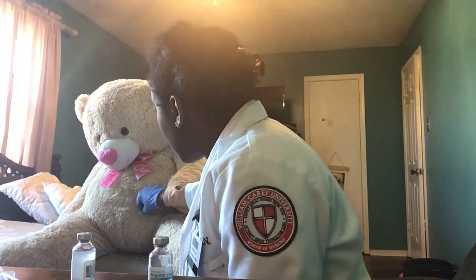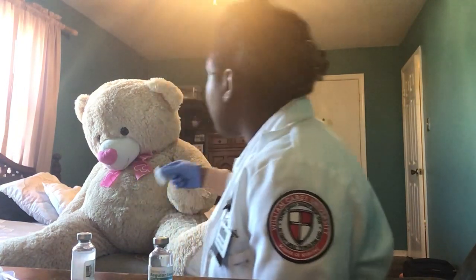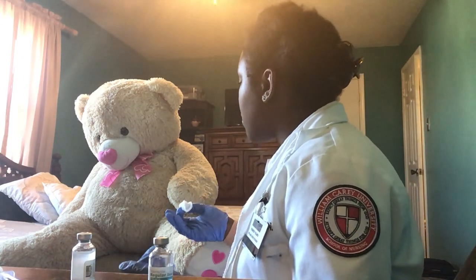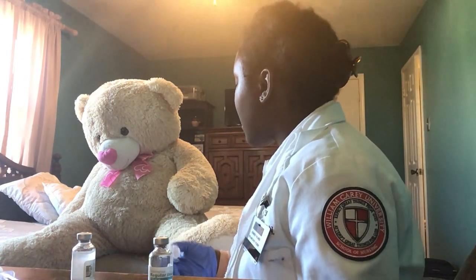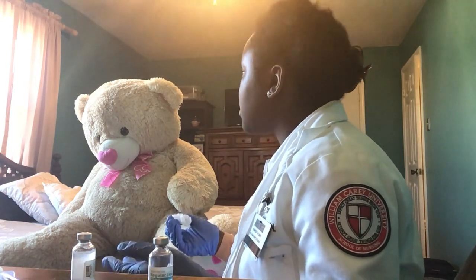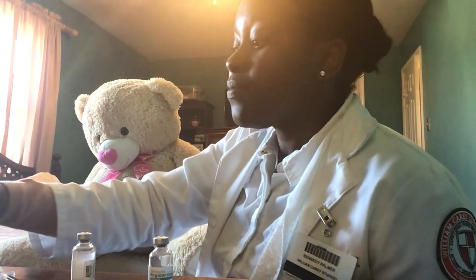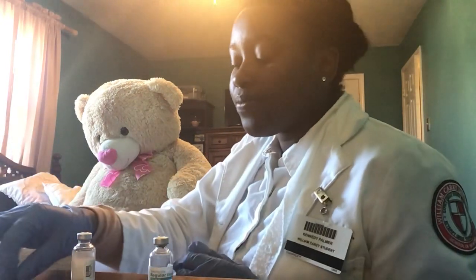I'm wiping the site. However, ma'am, if you did not want to use this site, you could also use the back of your arms. You could also use the front of your thighs and the love handle area as well to inject a subcutaneous medication such as insulin. Okay, I've cleaned the site.